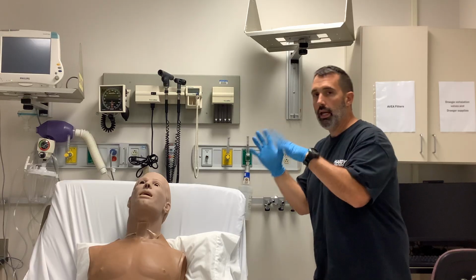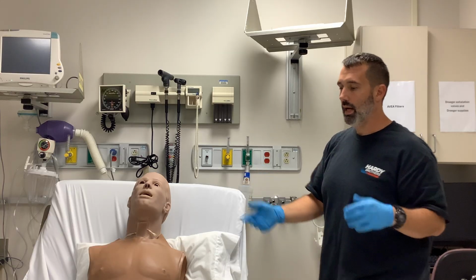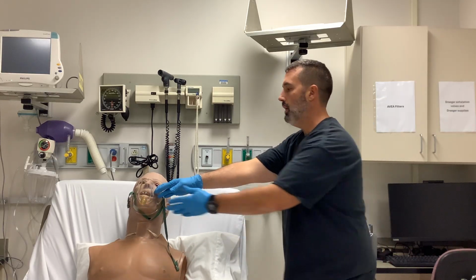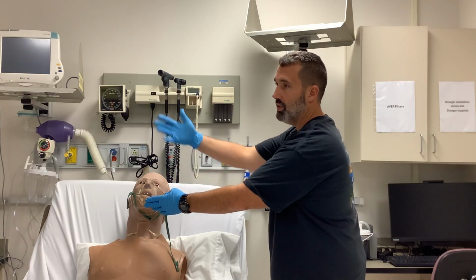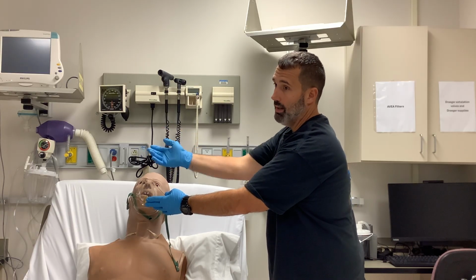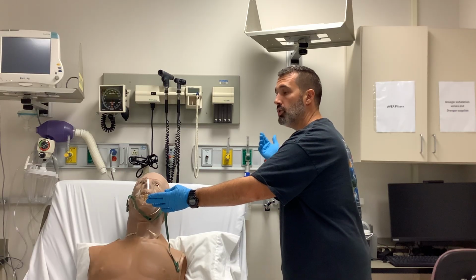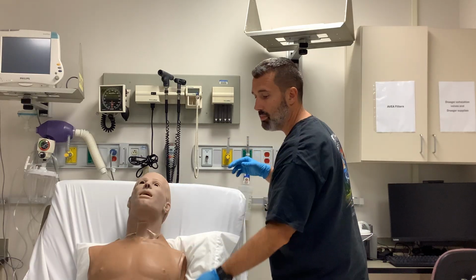Now, how do we gauge the peak inspiratory flow for our patient? There are ways in which to go about taking it, but if I've got an aerosol mask on here, a face shield mask, and I place this on the patient with the corrugated tubing hooked up to my large volume neb, and this is full of water, I'm going to see aerosol come out over this mask. You should see the aerosol spill over the mask. When the patient takes a breath in, if you see the aerosol go away, that's your clue to turn up the flow, because the output flow of this system is not meeting or exceeding the patient's peak inspiratory flow demand.